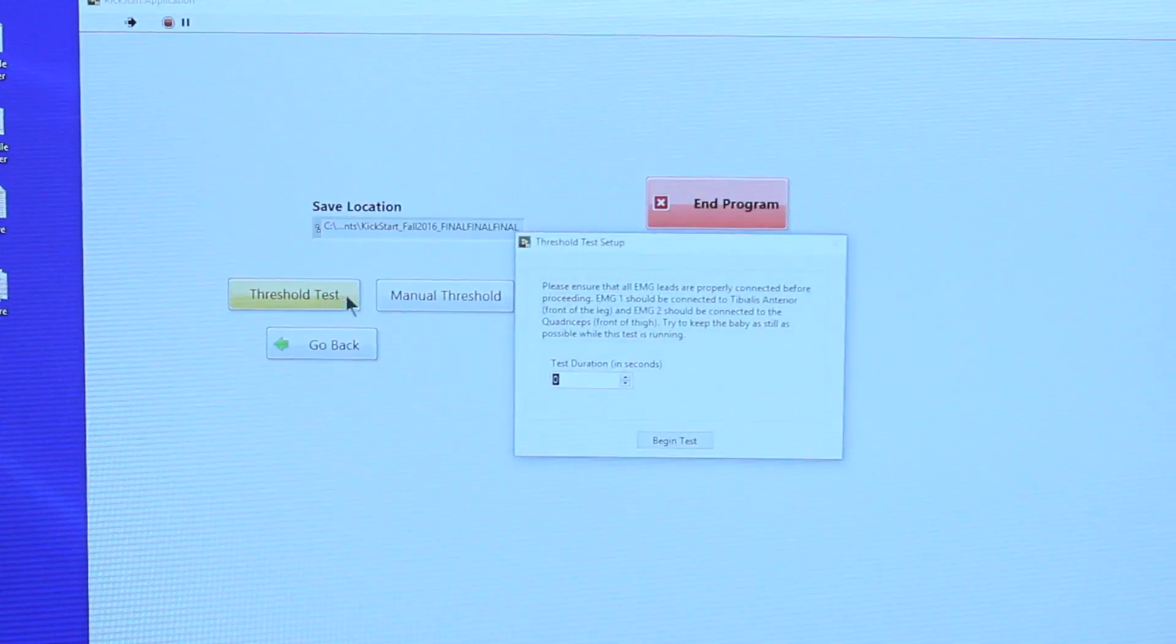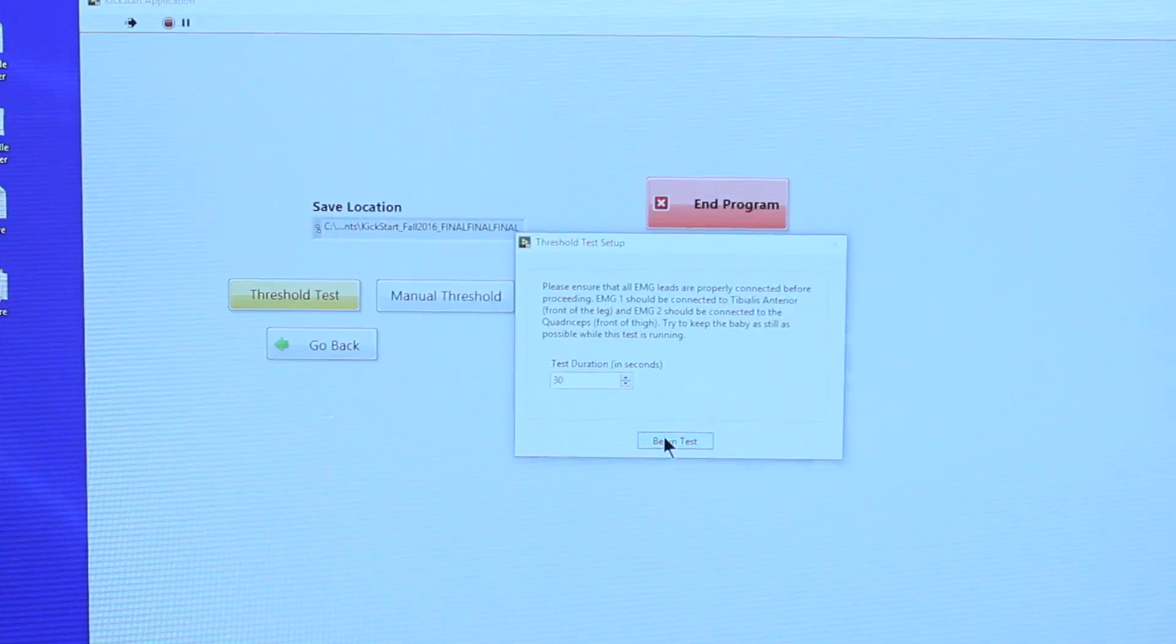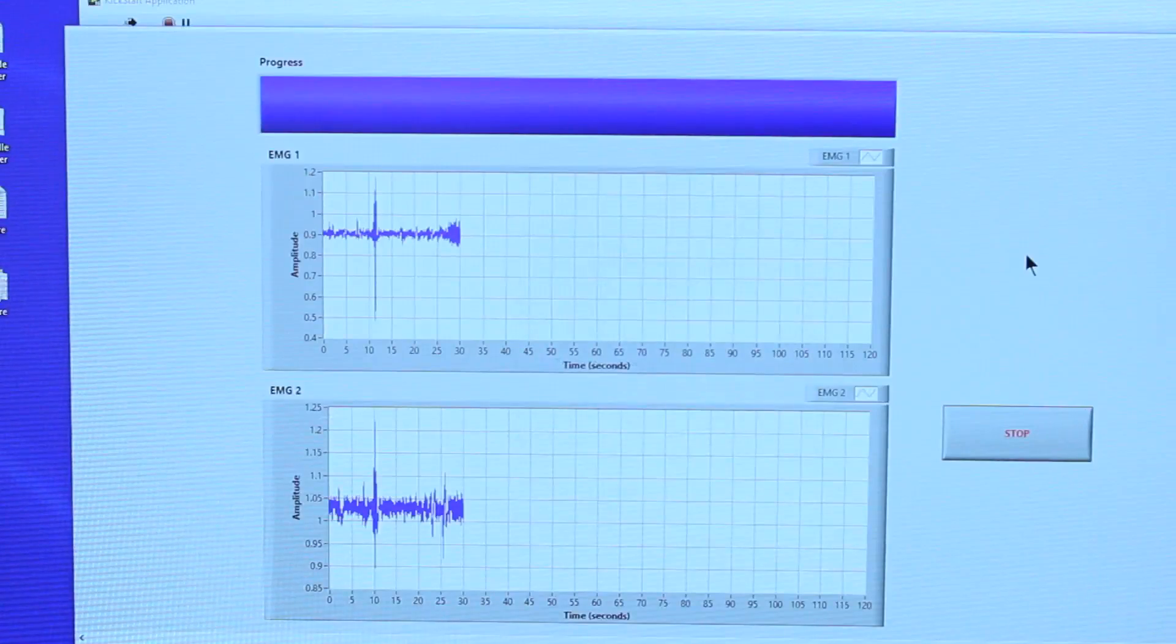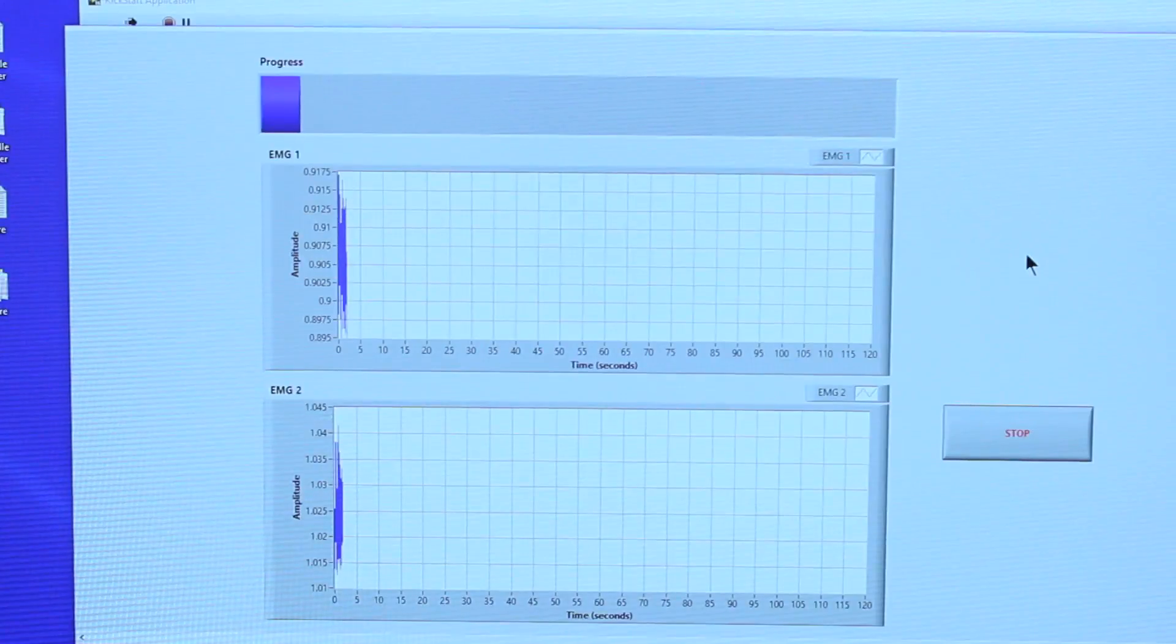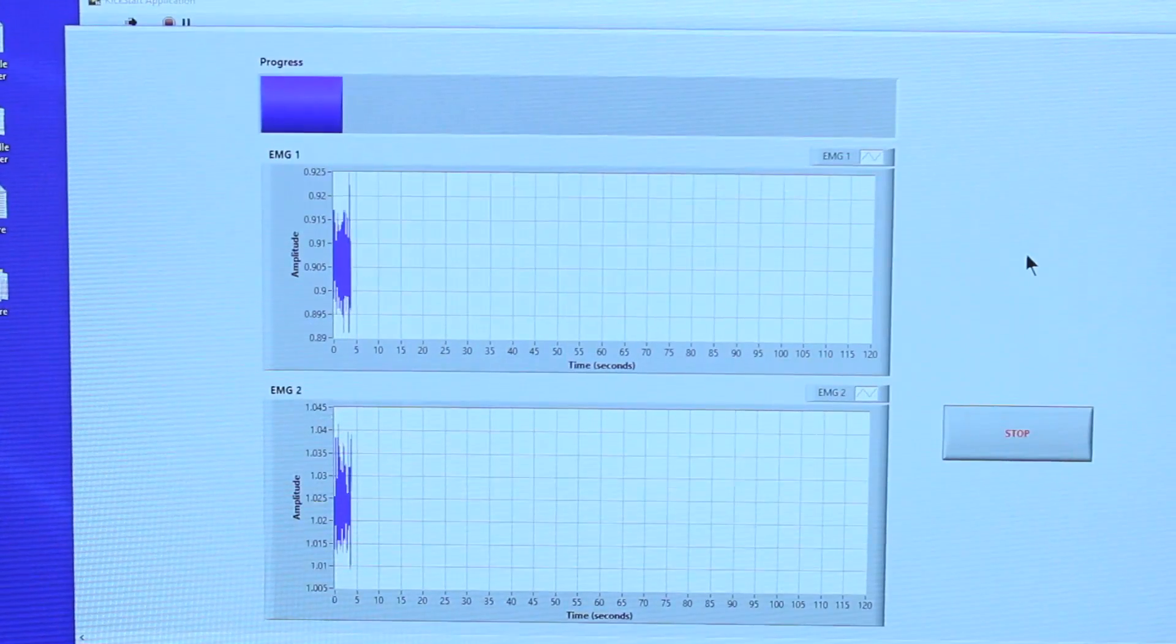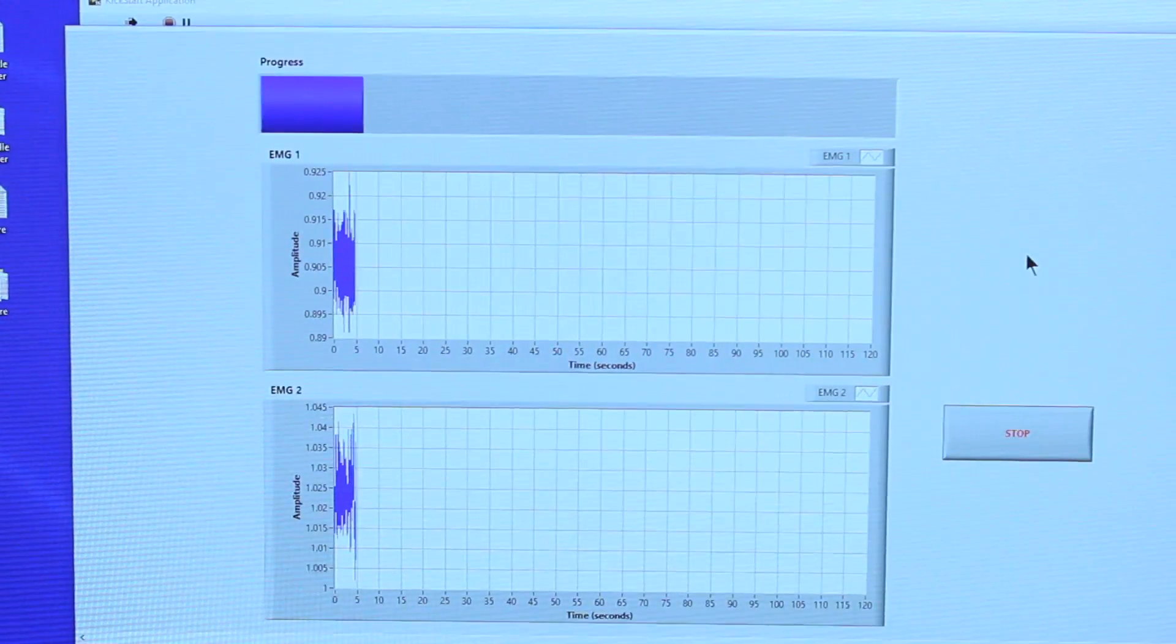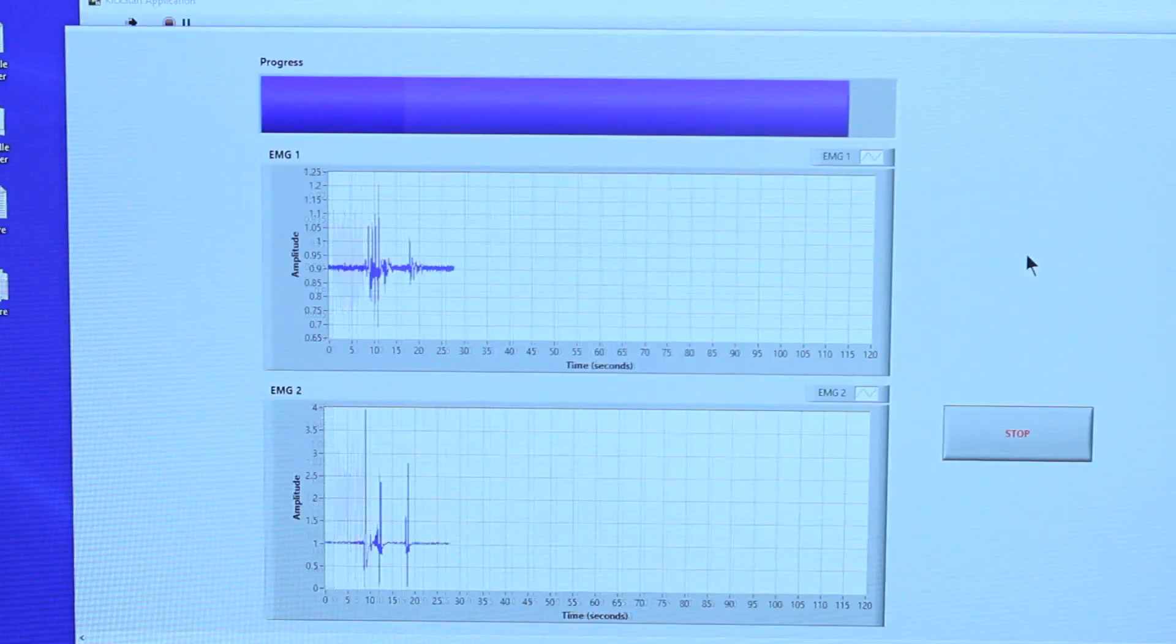To run the threshold test, simply click on the button and enter how long you want the test to run. A new window will pop up when this test is running. This determines the threshold from both EMG sensors using signal processing methods to filter out noise caused by random movement.